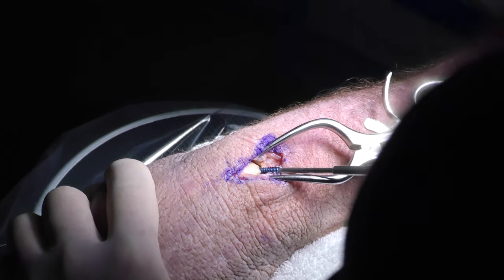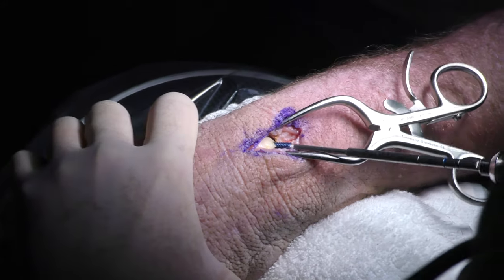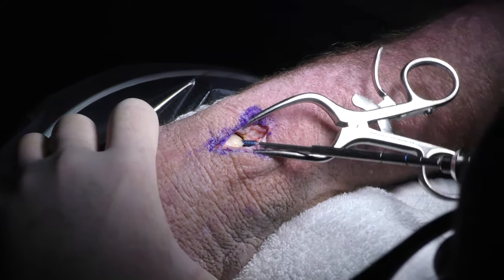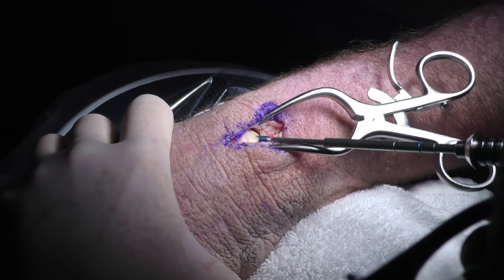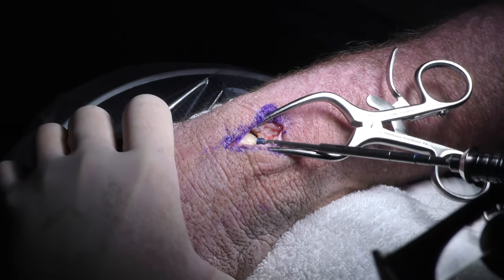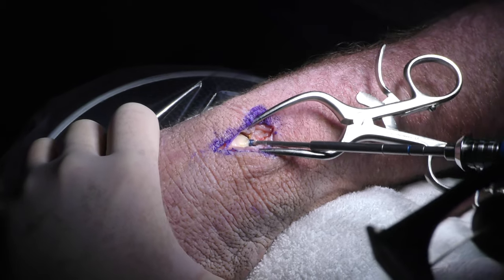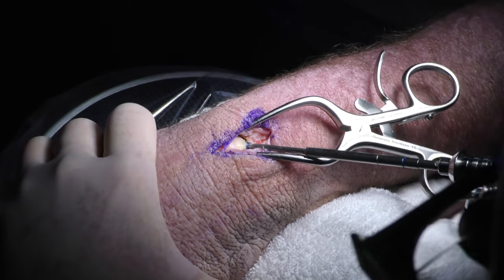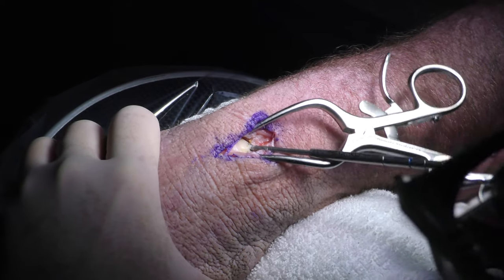And at times, you can use an anti-rotation pin if you would like. Certainly when you're doing this dorsal approach and you don't have much visualization to physically stabilize the distal fragment, that's not a bad idea. And it gets very tight. I always tell the folks that are doing this for the first time, turn slowly.